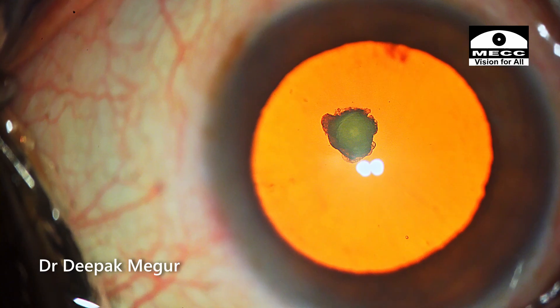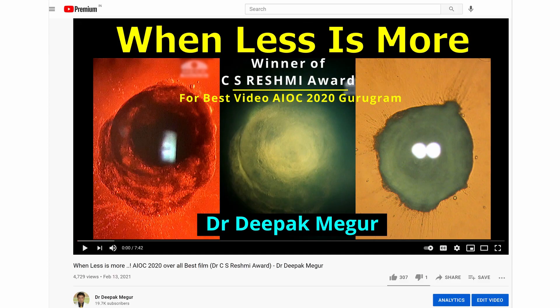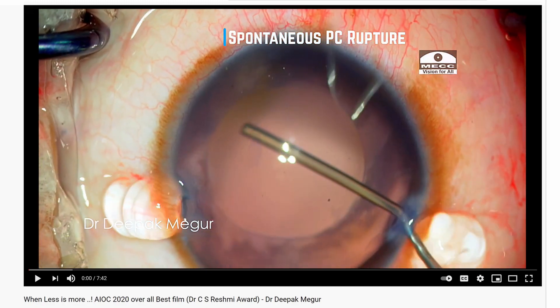My strategies are aimed to minimize the occurrence of posterior capsule tear. I have previously published a video titled 'When Less is More,' highlighting the importance of performing a low pressure surgery in polar cataracts.